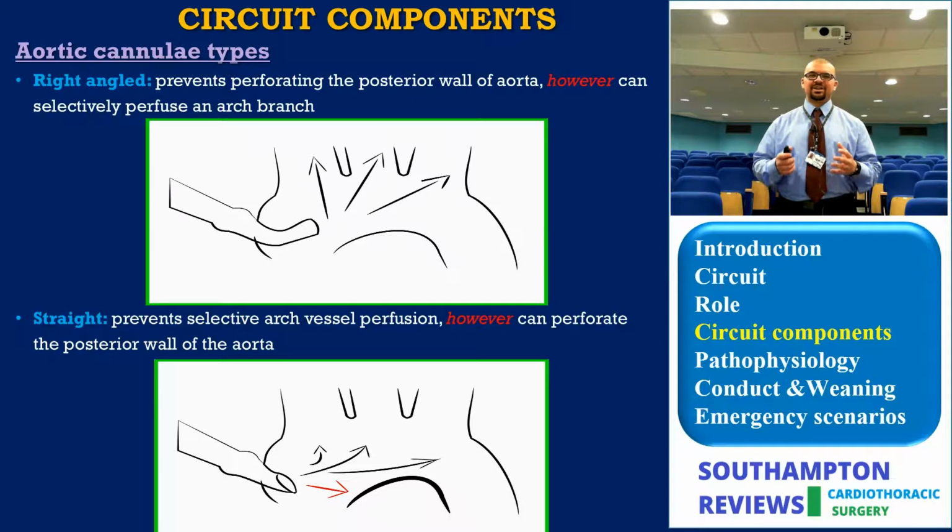Academically speaking, theoretically, when we study the types of cannula, we study them as characters of the tip, the body, and the additives. However, that's no longer the case. So there is nothing like a right-angled cannula only. You will find a cannula which has multiple features, such as a soft diffusion tip, as well as wire reinforced, with a flange, without a flange, with a donut, without a donut, and so on.